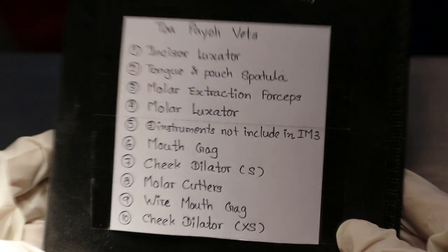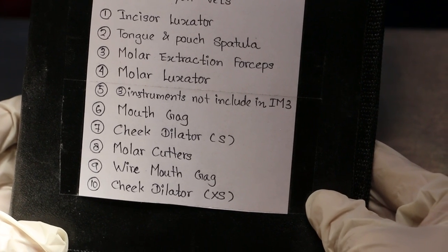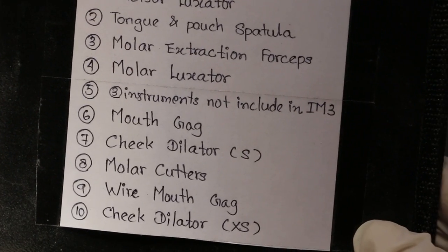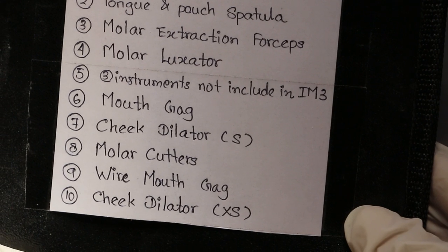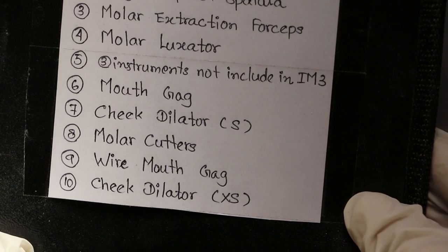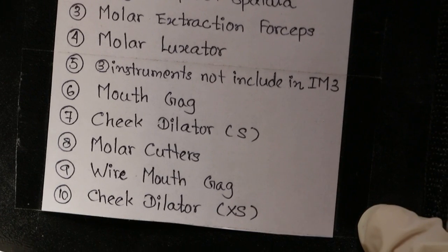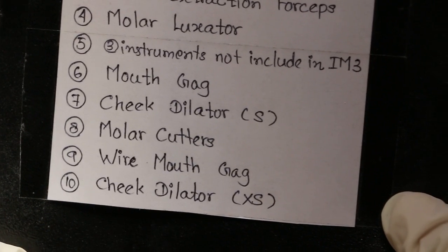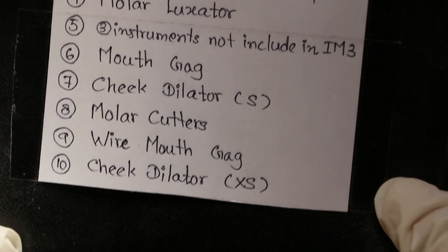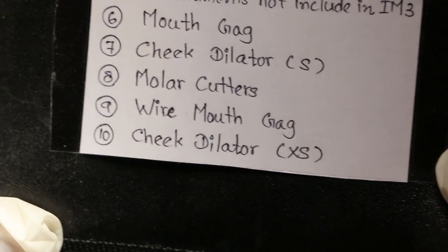Number one: incisor luxator. Number two: tongue and pouch spatula. Number three: molar extraction forceps. Number four: molar luxator. Number five: an instrument used for filing the teeth, but it's not included in the set. Number six: mouth gag. Number seven: cheek dilator. Number eight: molar cutters. Number nine: wire mouth gag. Number ten: a cheek dilator but for molars — extra small.